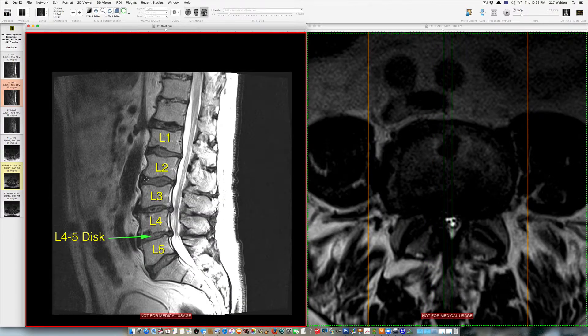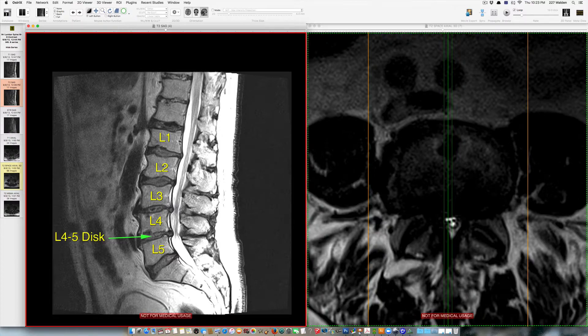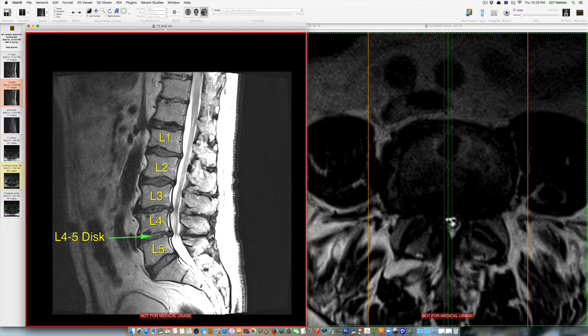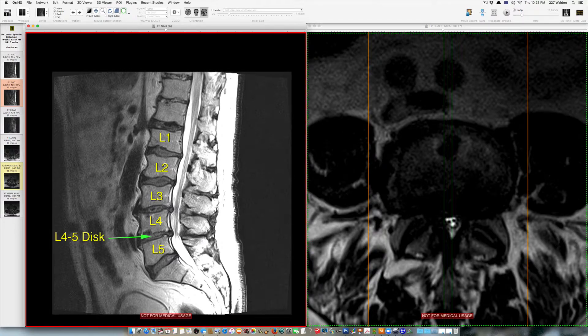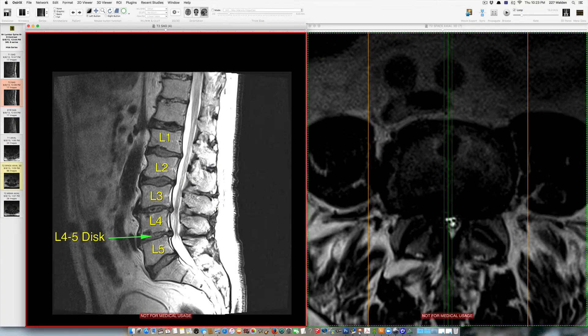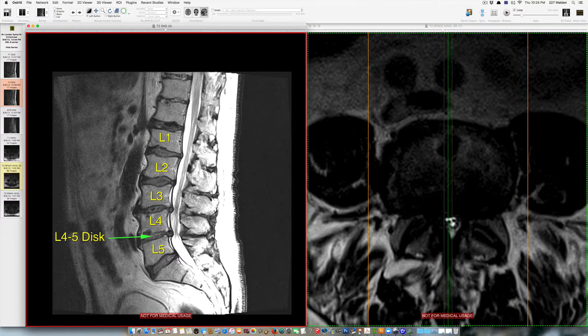Here in the center of the spine I've labeled the vertebral bodies. This is L1 here, L2, L3, L4 and L5. Those are the bones of the spine and in between each of the vertebral bodies is the intervertebral disc, and we name the disc according to the bones that it separates. So here I have an arrow pointing to the L4-L5 disc.